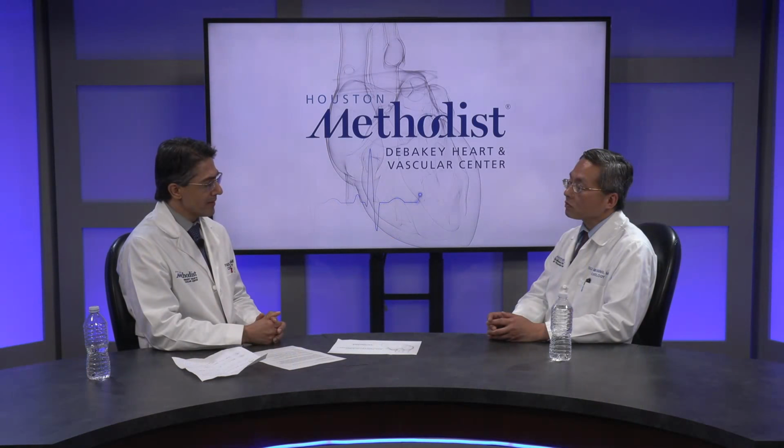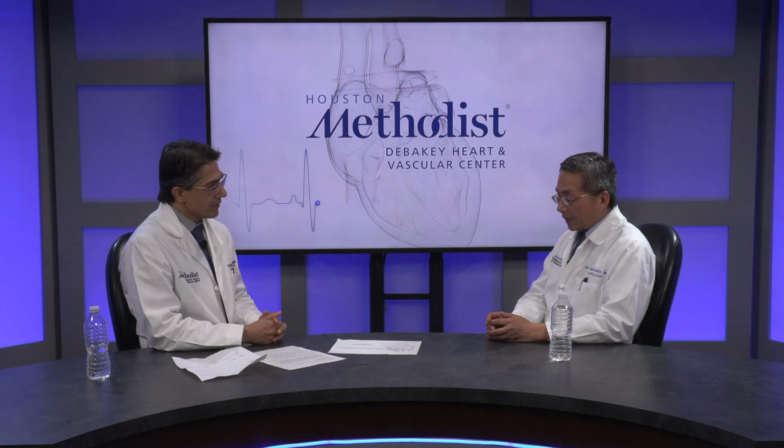And what does it mean to have a normal CTA? Yes, normal CTA means you do not have any plaque. And those patients followed up to 5 to 8 years, the risk of death or cardiovascular death or myocardial infarction is as low as you can get. We're talking about 0.2, 0.3% per year.